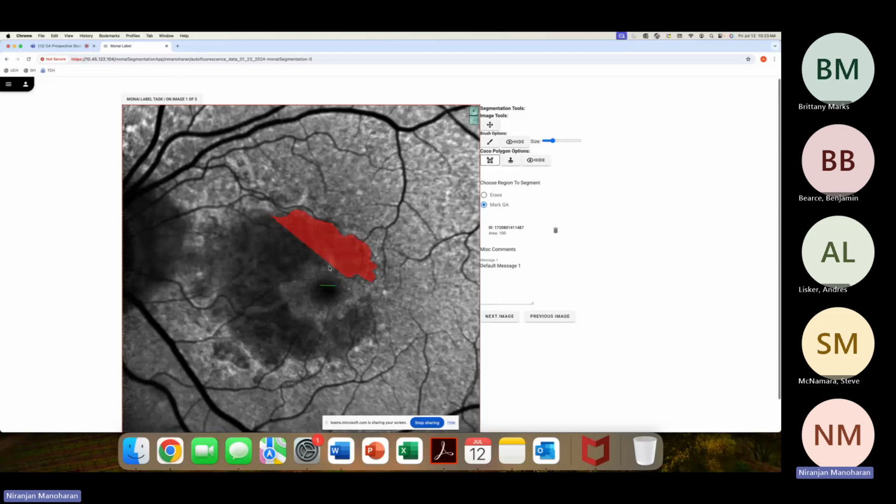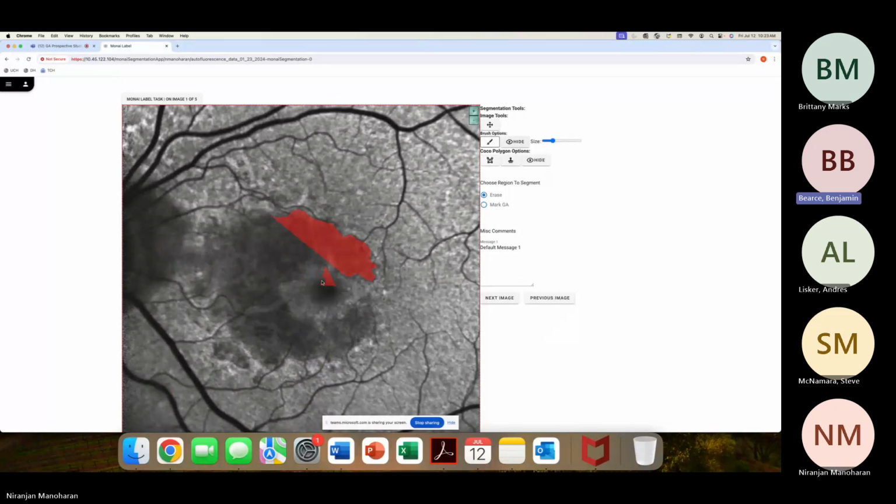You'll get some practice over time, noticing that. But I find the polygon was probably the easiest way to mark the large lesions. It's deleting the polygon object and it's leaving the paint. Yeah, there we go. And then for the smaller lesions, you could do whatever you want. You could do a brush, or you could do a more basic polygon just by clicking a few spots.